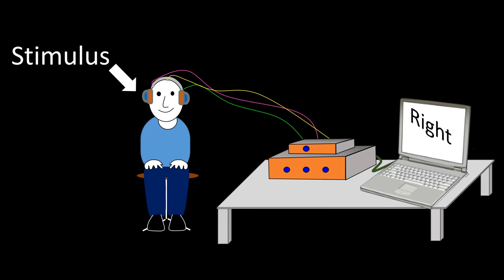The stimulus is given to a single ear, that is monaural stimulation. The stimulus intensity can be given in decibel peak equivalent sound pressure level, as it is recommended by the Academy, or in decibel sound pressure level. If you do not understand these units, go to the video titled Sounds for Neurophysiologists on this channel and hear it and see it. Maybe that way you will understand it.